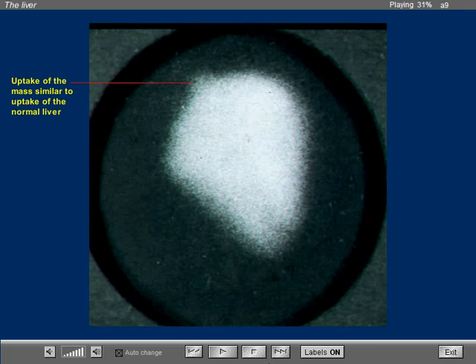So there was no question that by the CT study and the phagocytic liver scan that this is normal hepatic tissue. So my recommendation to the parents of this child was to leave the child alone, that there should be no surgery, because we had proven by non-invasive imaging modalities the presence of what I considered an example of intrathoracic accessory liver. I had seen a previous case that I will now show you.